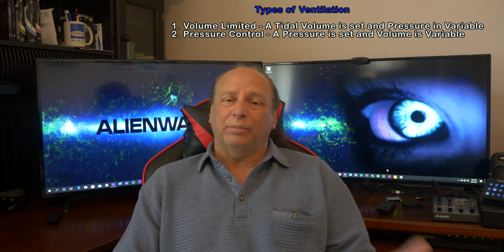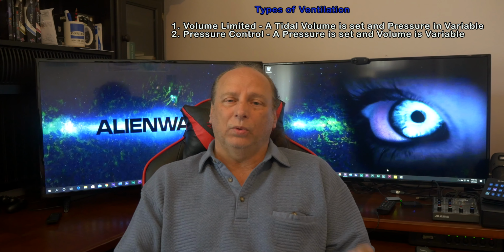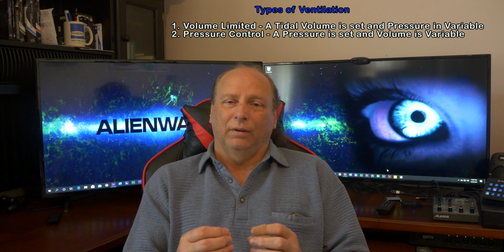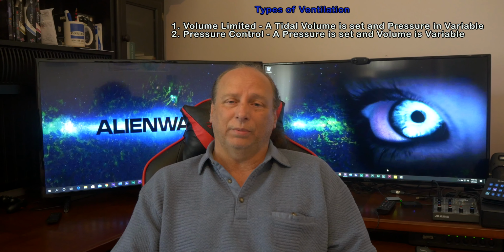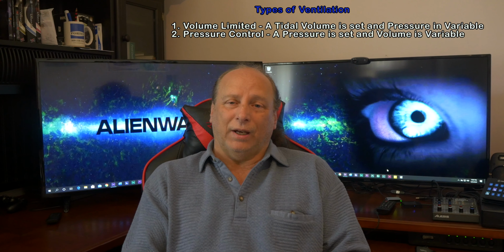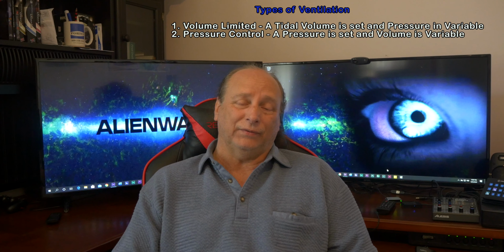So the other type of ventilation, pressure control, is quite the opposite. We set an initial pressure, and that pressure is going to be given. But then the volume is variable. So let's say we give 15 centimeters of pressure to a patient. You watch their tidal volume, and let's say, for example, their tidal volume goes up to 200, but the doctor ordered he wanted 350.